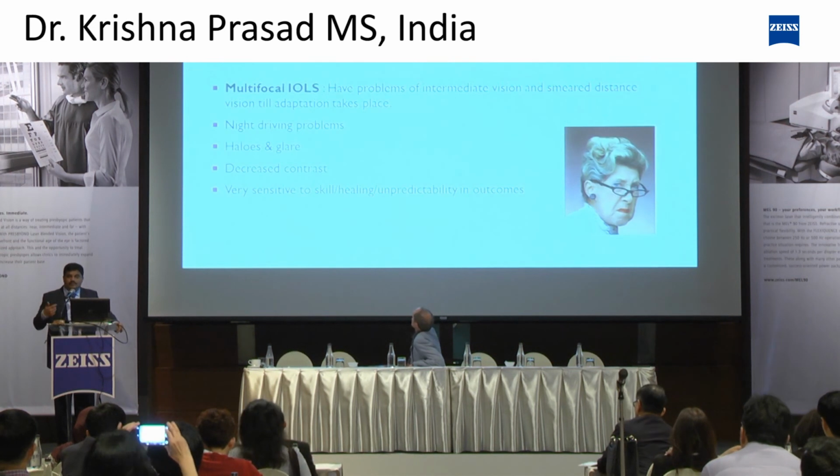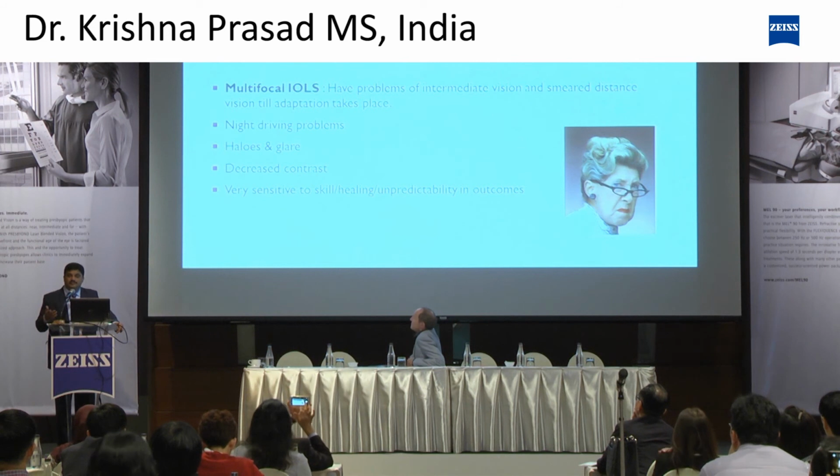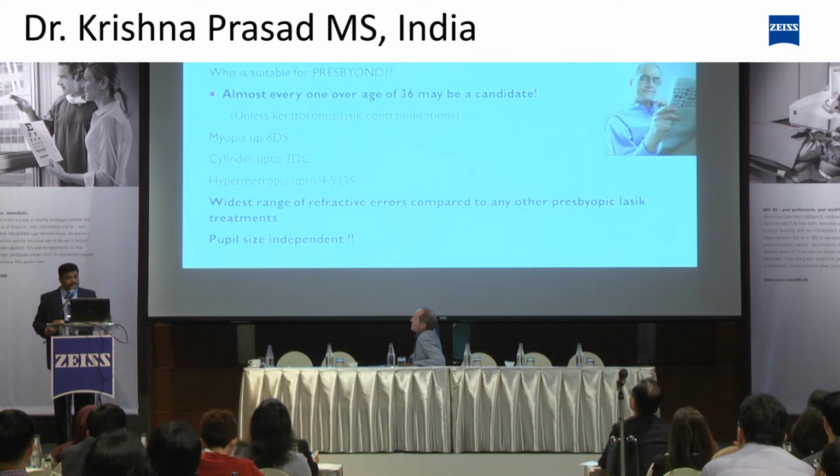And of course, I do a lot of multifocals, especially for patients with cataract, multifocal and trifocal. But you all know the problems with these IOLs: the patient complains of halos, glare and night driving problems. Of course, very important, decreased contrast sensitivity, and they are very sensitive to skill and unpredictability in outcomes.